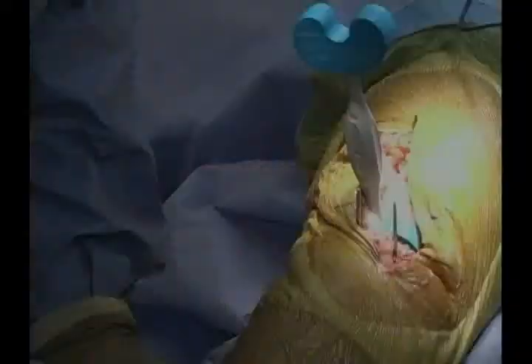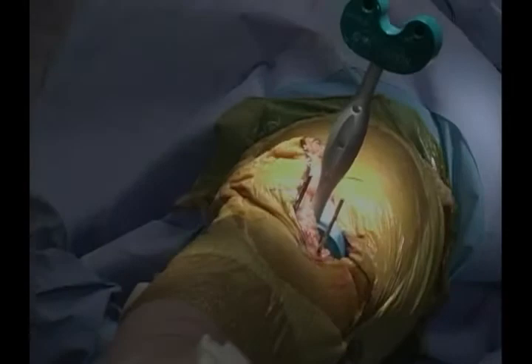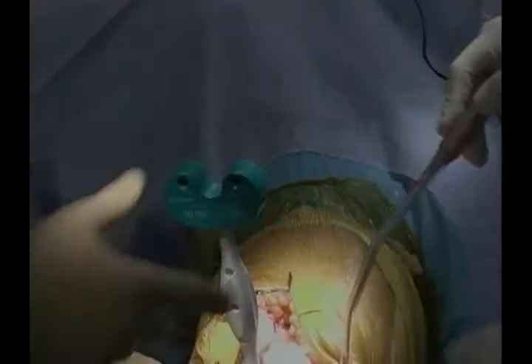Let's put the extension side of the spacer block in. There's an extension side and a flexion side — this is the extension side. I'll assess my stability here. My lateral side is just slightly more lax than my medial side, which would be consistent with her deformity.